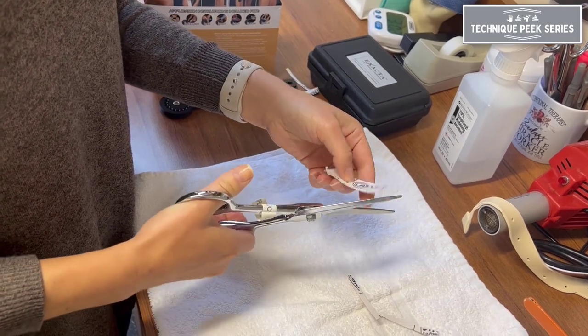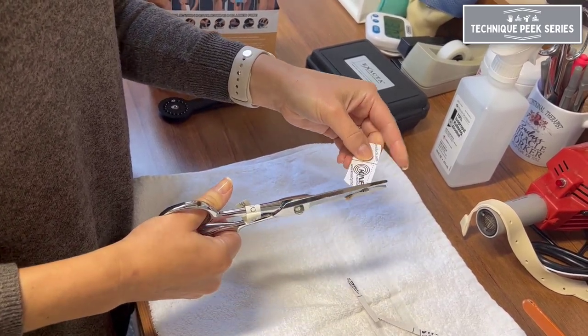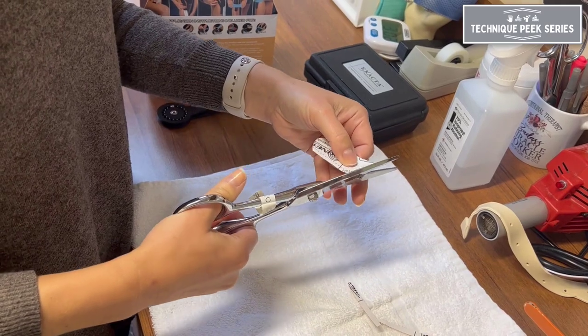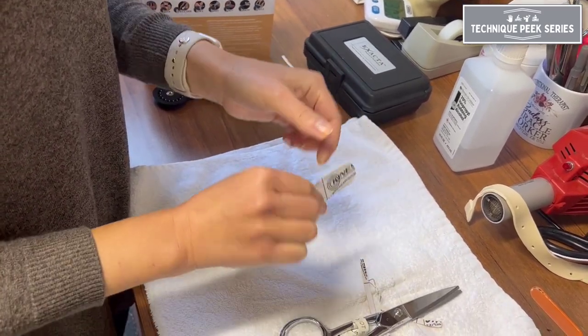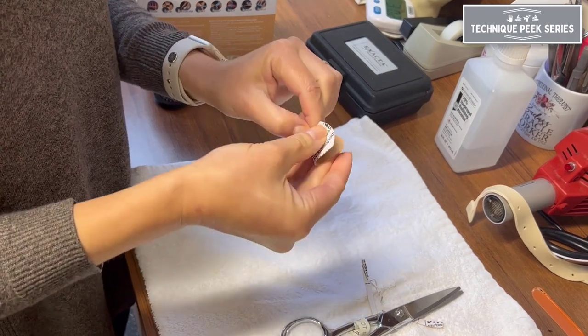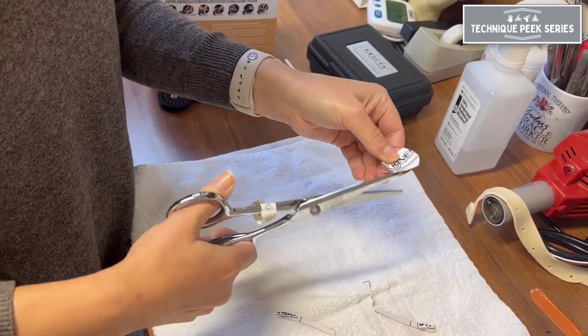Once your piece is cut, be sure to round your edges for better tape adherence to the skin. Once you've determined that your piece is of appropriate length, you'll want to cut the fan shape by folding the material in half and cutting along the paper side.